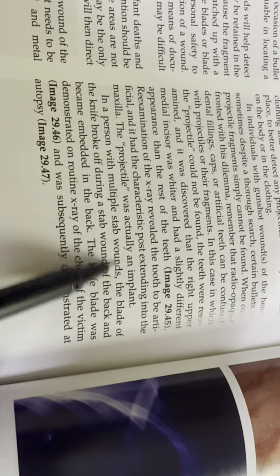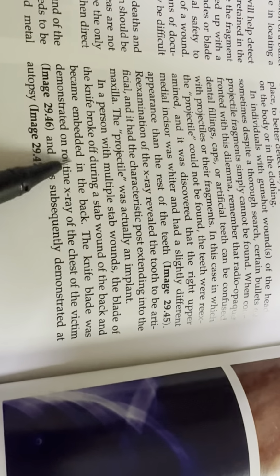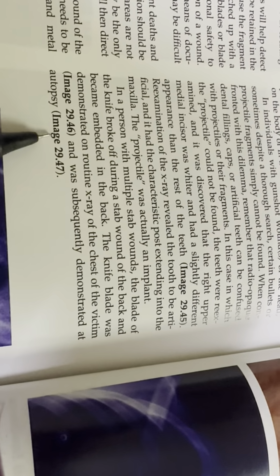In a person with multiple stab wounds, the blade of the knife broke off during a stab wound of the back and became embedded in the back. The knife blade was demonstrated in X-rays of the chest of the victim, and subsequently demonstrated at autopsy.